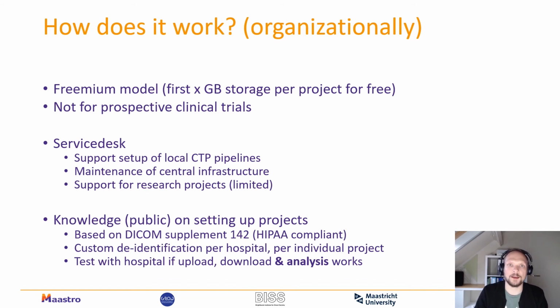Otherwise, we can't calculate several information elements based on the PET data, which is a common need. So it really starts from supplement 142 and then makes deviations where the hospital really needs this information included, and therefore there's also a link to why you really need this information.